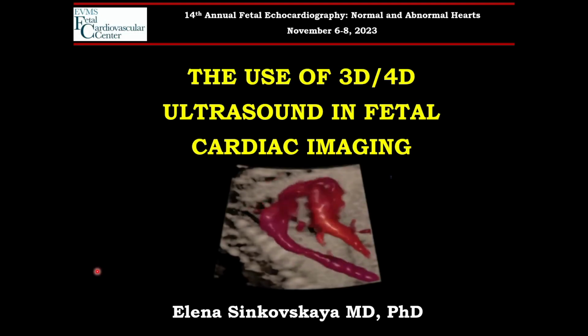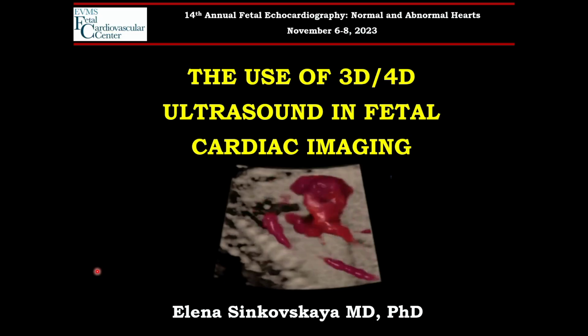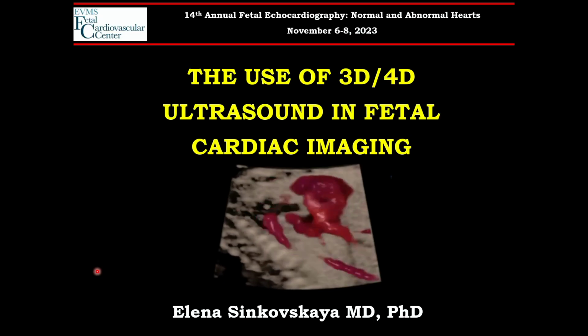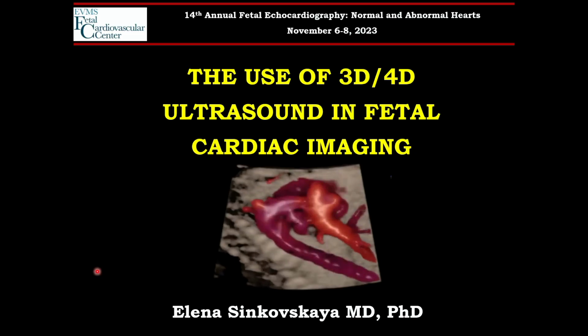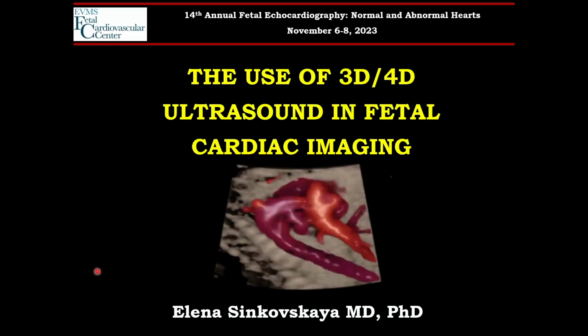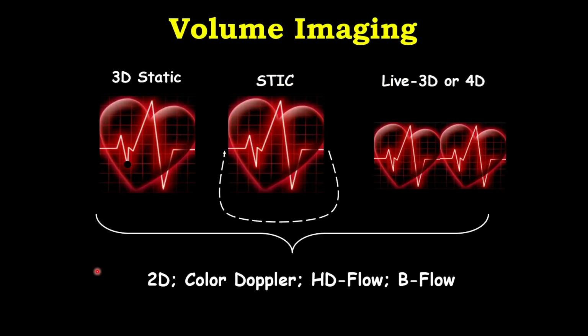Let's switch gears and talk about the top technologies in fetal cardiac imaging, and it's going to be 3D and 4D. I think it's generally perceived that 3D and 4D is something very sophisticated and only a few experts in the world can do. But I hope that today I will convince you that it's not that difficult. And I promise to show you a bunch of beautiful pictures, so please sit back and enjoy them.